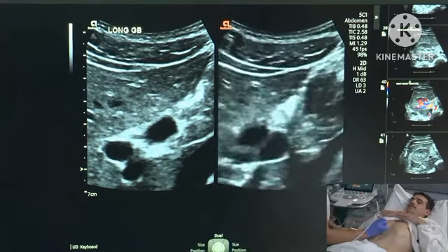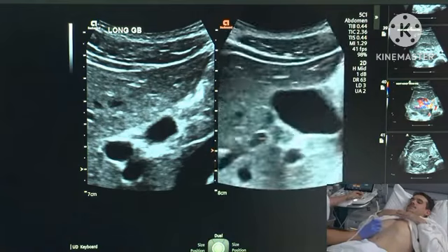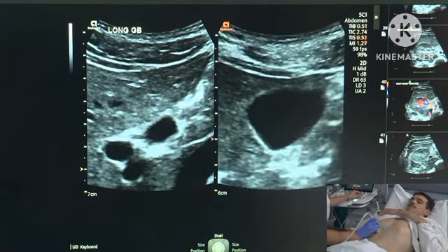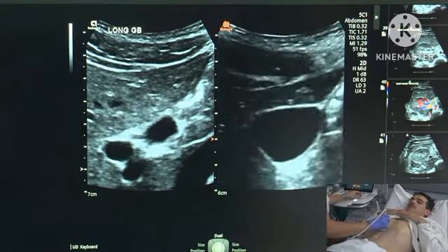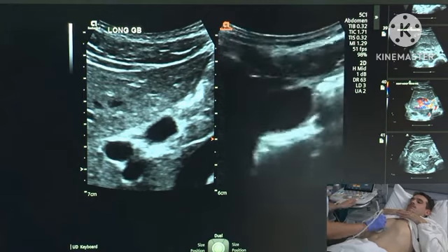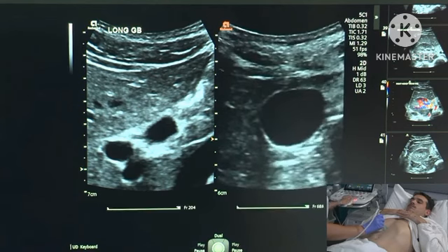Now I'm going to get ready and move down towards the fundus. Big breath in. And see how I move my transducer inferiorly, the fundus is moving more anteriorly. And we want to make sure that we have a really nice place where we can measure the wall and prove that it is nice and thin. So about there where I can feel quite confident, breathe normally, I can see the borders.